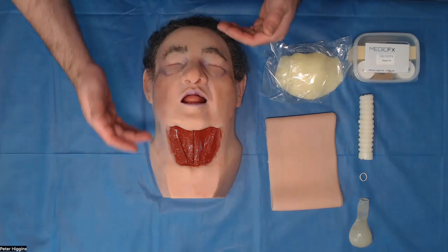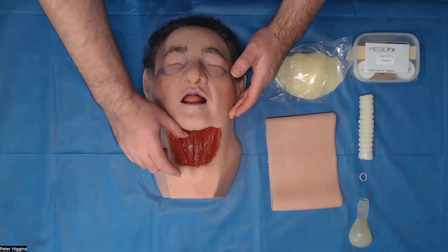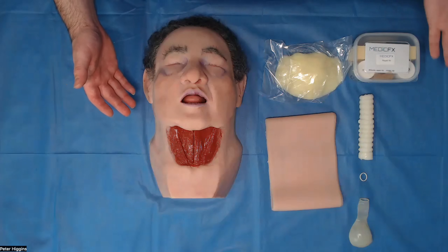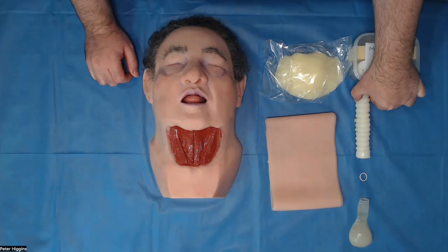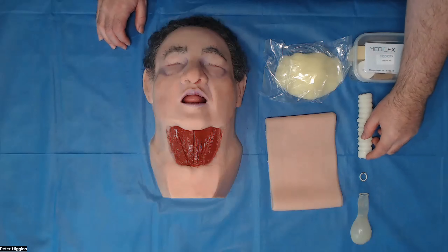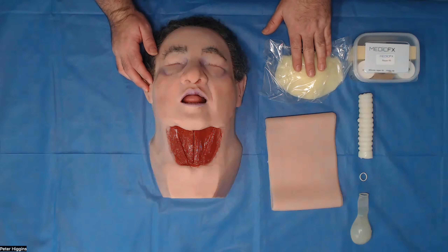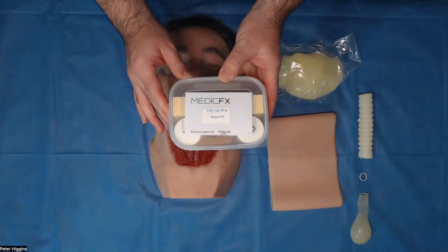So this is Conan, our standalone skills trainer for can't intubate, can't oxygenate scenarios for front and neck access in the obese patient. These are the items that it comes with: a neck skin, a trachea, a small balloon to place on the end with a little rubber band to keep it in place, a fat pad, as well as a full silicone repair kit.